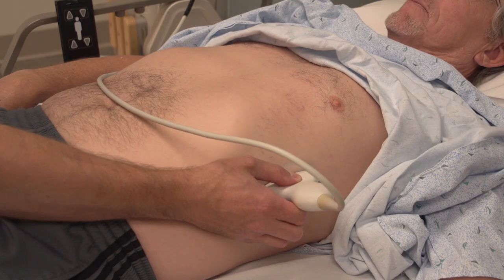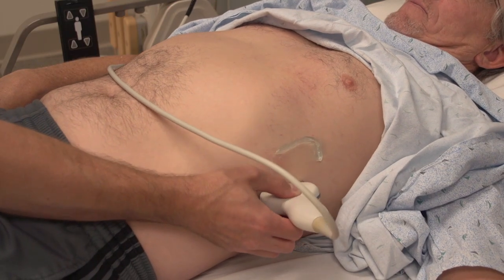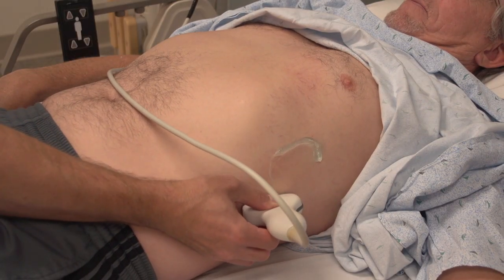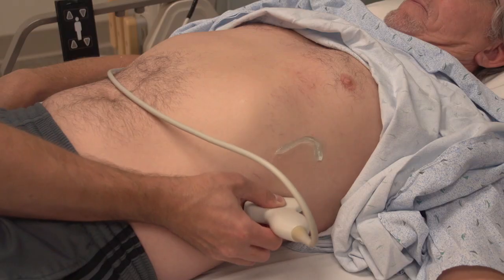The patient may need to assist, for example by changing position or inhaling deeply. For the best view of an organ, image both dimensions and tilt the probe to focus on each end.